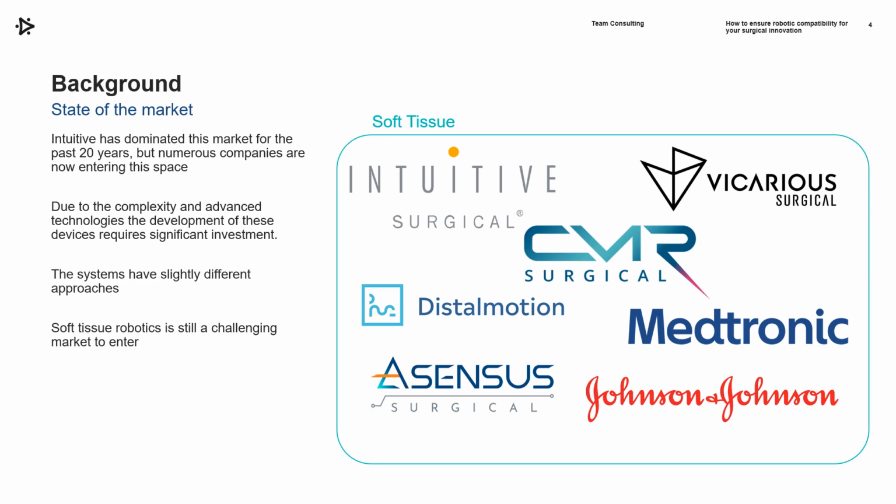Now, although these systems are all aimed at the same kind of procedures and market, it's quite interesting how they have slightly different approaches. Some are a more immersive user experience, whereas others are going for a much more open sort of framework and experience. Some have gone with wristed instruments, whereas others have stuck to more traditional straight stick laparoscopic style instruments, veering less away from that approach. Some are with arms that are individually mounted and positionable around the bed, whereas some go with a single column with all the arms mounted to it.